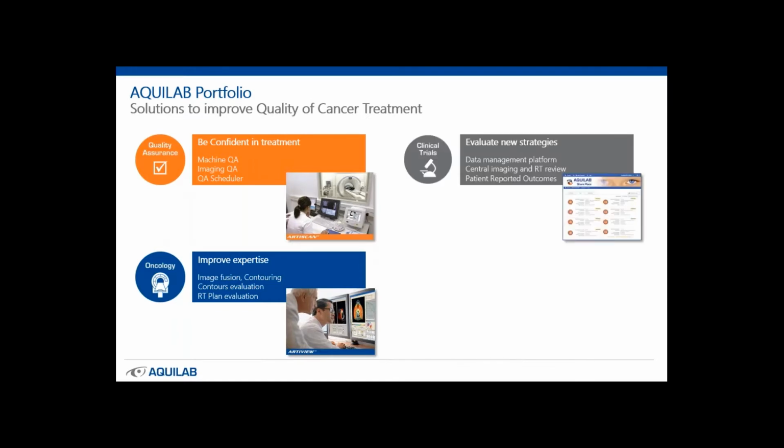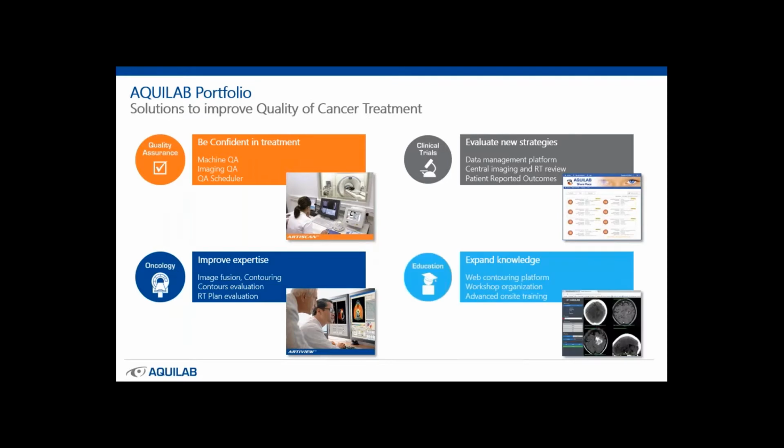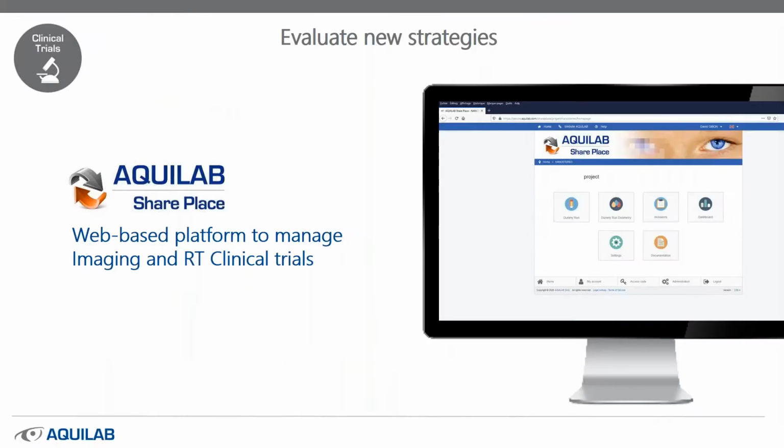Another major activity is the quality of clinical studies to better evaluate new strategies. And this is the topic of today, our web platform Share Place that centralizes and analyzes imaging and radiotherapy data. Finally, AQUILAB is strongly involved in the training of radiotherapy professionals with online contouring tools dedicated to education and the organization of workshops.